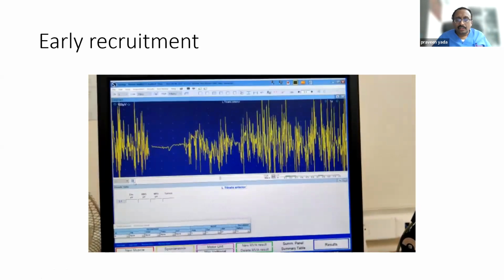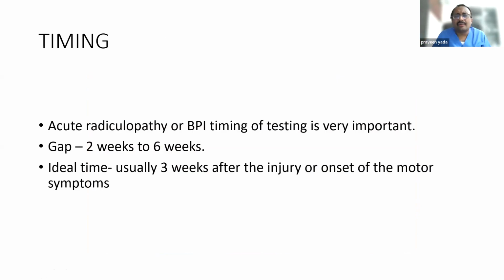Now, these are a few important things which I have seen our examiners ask. They can ask about the electrode. Even in the spotter, they can keep a needle and ask you what type of needle this is. You can look at it, whether it's a concentric or a single fiber EMG.